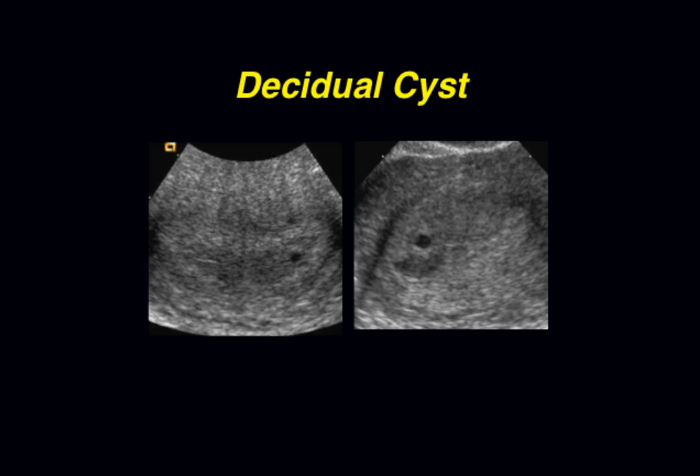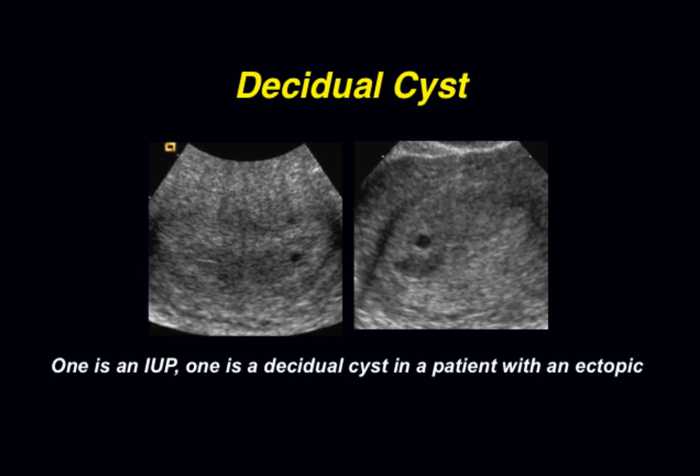The reason I do not include the intradecidual sign as a definitive sign for an intrauterine pregnancy is an entity called the, quote, decidual cyst. In their original paper describing the decidual cyst, Levy and Lyons entitled the paper, quote, the decidual cyst, endovaginal sonographic sign of ectopic pregnancy, end quote. They noted decidual cysts in 14% of ectopic pregnancy patients.